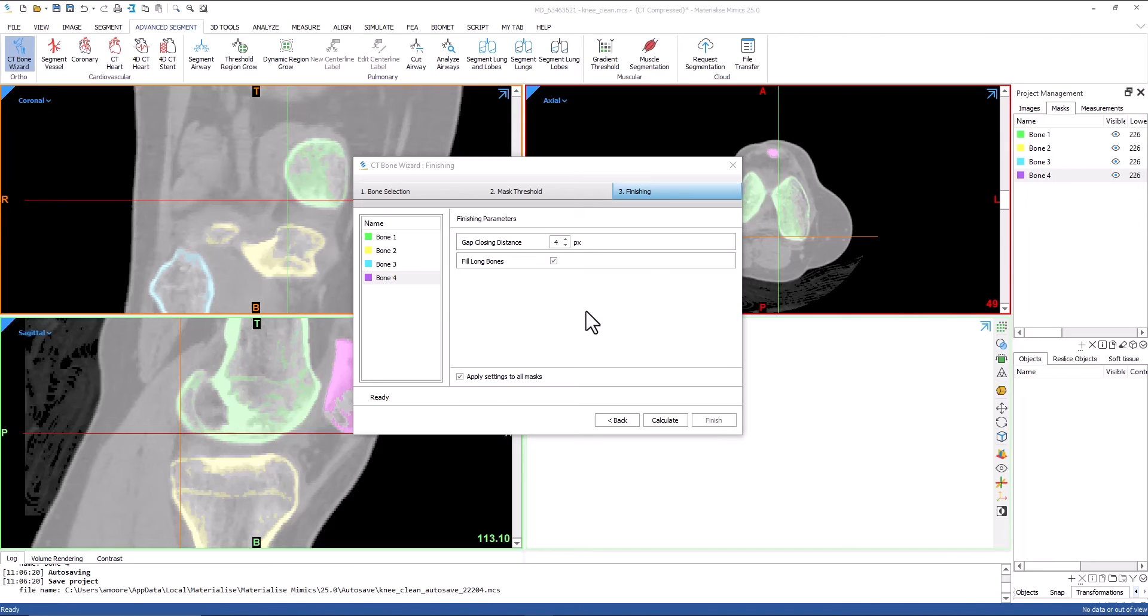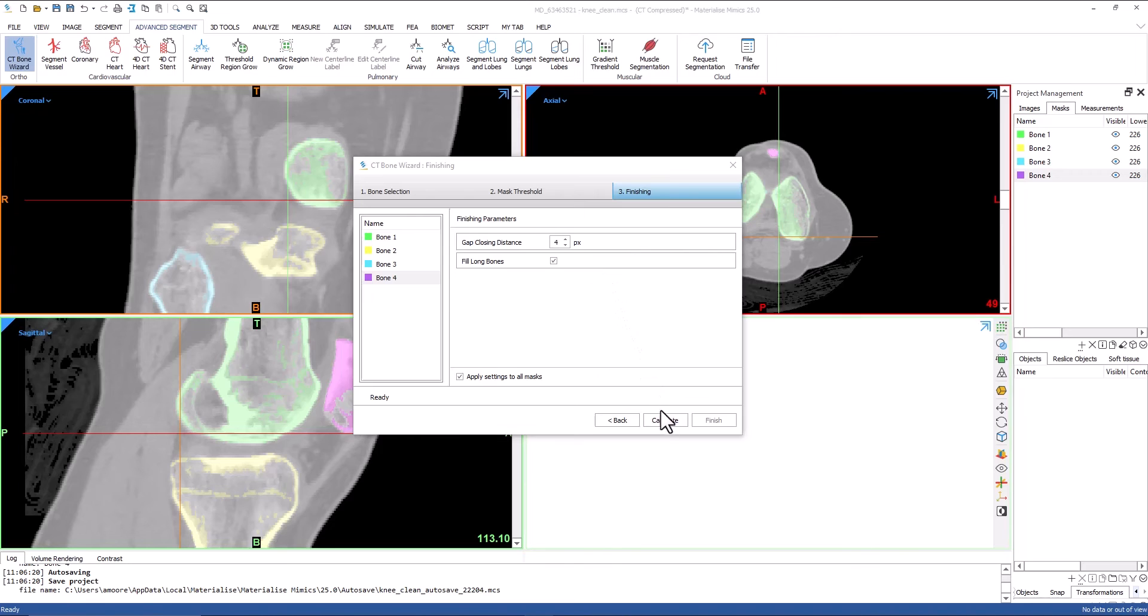Fill long bones will fill the shaft of long bones. This should only be checked when dealing with long bones like the femur, tibia, ulna, etc. Similar to the second step, the finishing can be applied uniformly to all masks, or individually. Once I set my parameters, I will click calculate.